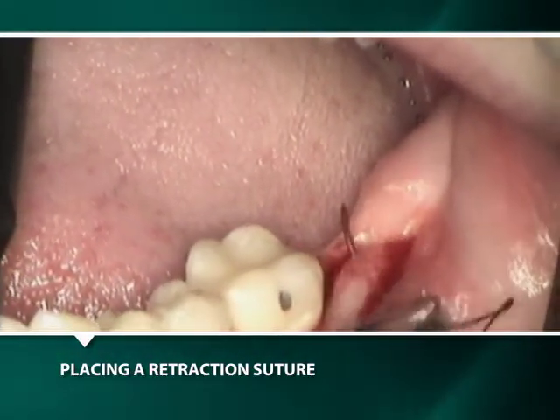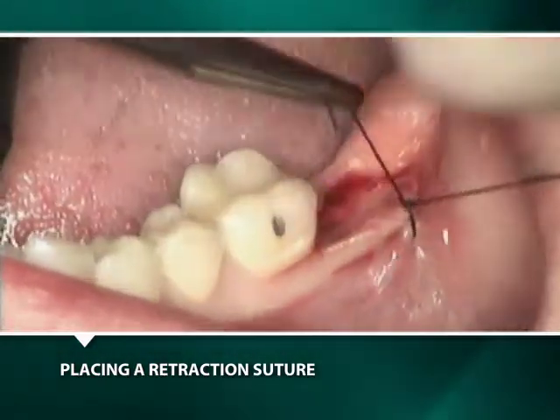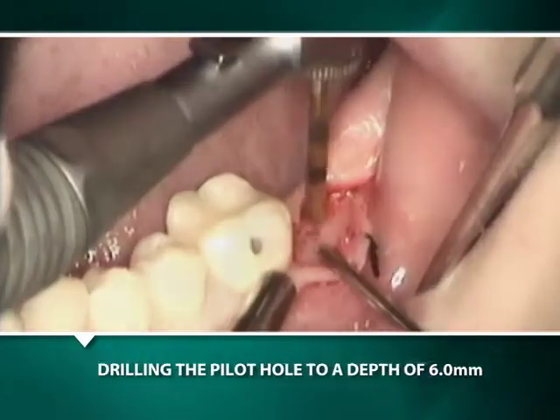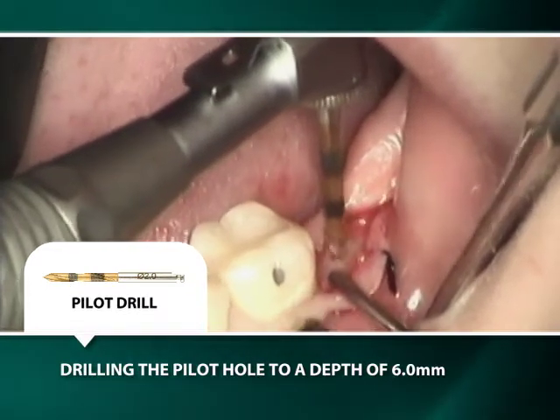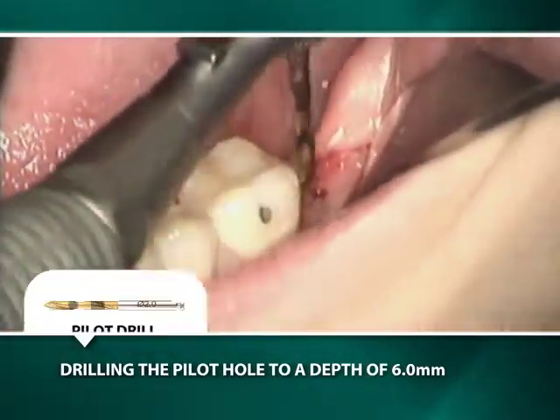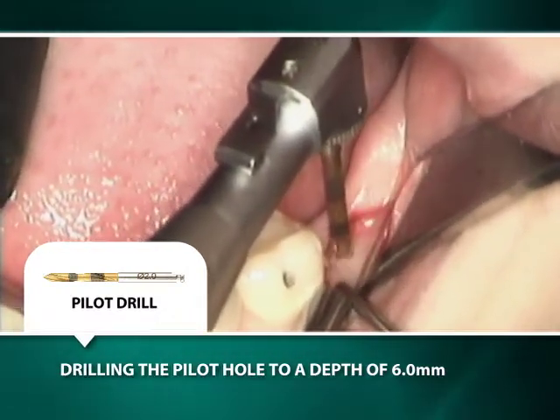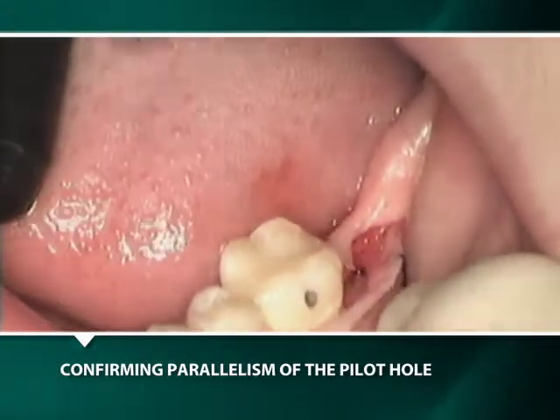Since the intended implant is 5 mm in diameter, we shall initiate the pilot osteotomy 8 mm distal to the first molar. This will provide a 2 or 3 mm space between the implant and the molar. Ideally the pilot burr should be centered in the middle of the intended tooth with the same trajectory as the first molar. Initially the pilot osteotomy will be made to a depth of only 6 mm, which will not only allow for change in the osteotomy's trajectory but also its positioning.